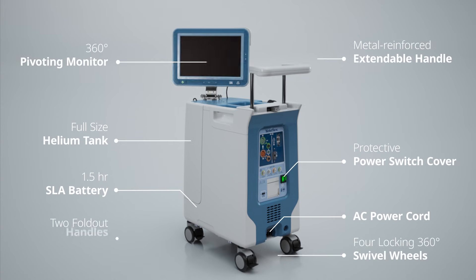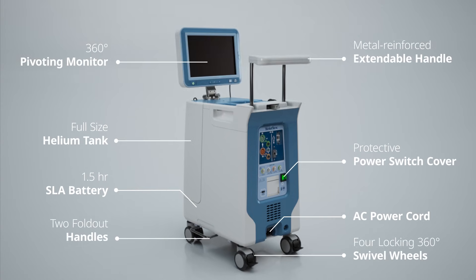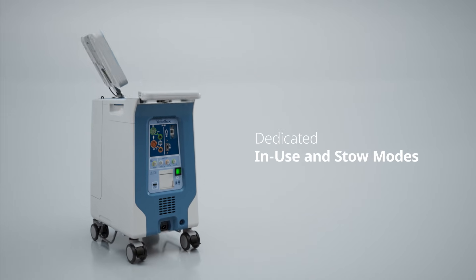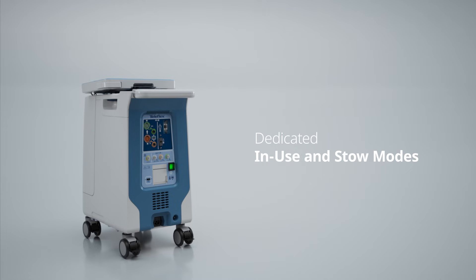The AC3 Range integrates each of these features into a streamlined, transport-ready system with dedicated in-use and stow modes for reliable performance and secure storage.